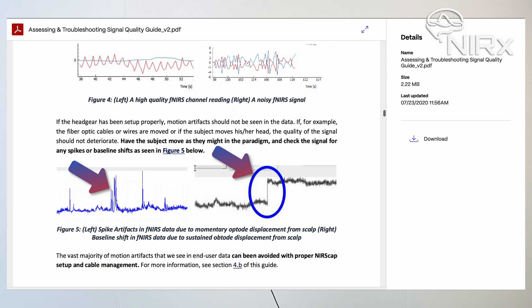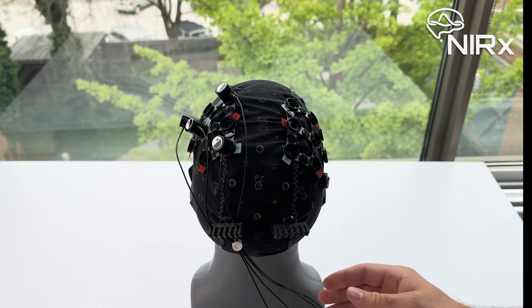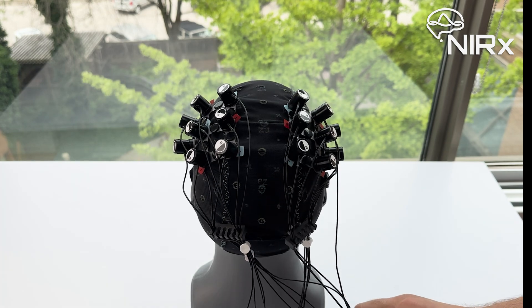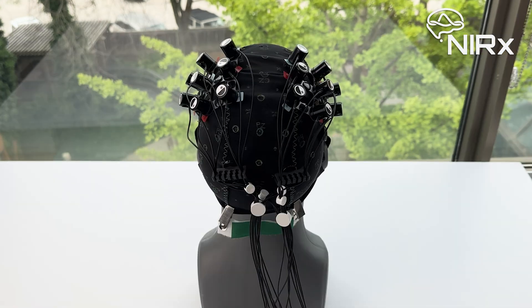Spike and baseline shift motion artifacts can occur when an optode's contact with the scalp changes during recording. Populate four sources or four detectors at a time. After each bundle of four optodes, slide the cable tie towards the cable tree to create a tight organized bundle of cables. Repeat the steps to insert the remaining optodes, ensuring proper slack is given to each optode.